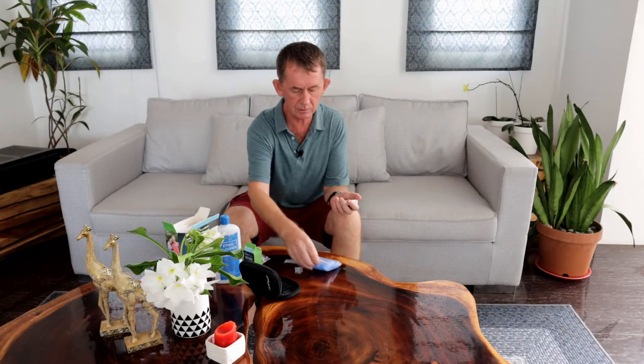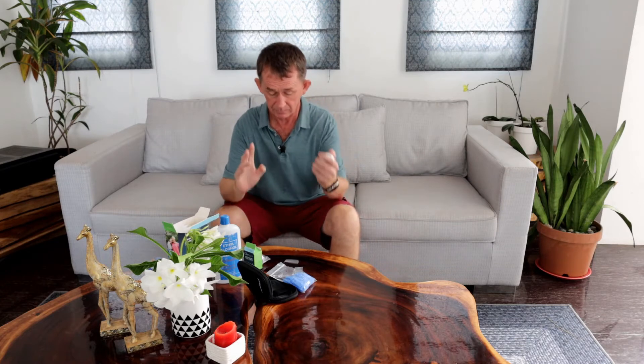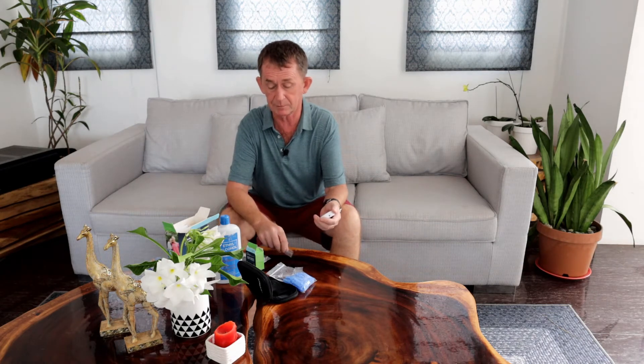All glucometers are made to a world standard which states that they should be accurate within 15% ninety-five percent of the time, and within 20% ninety-nine percent of the time. So you could do two tests and get readings 15% apart — that's within the world standard.